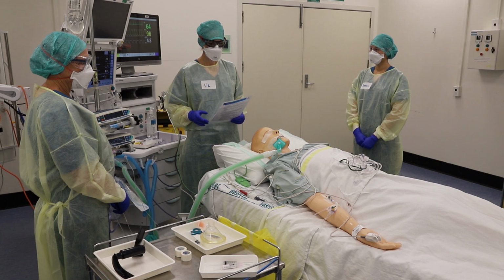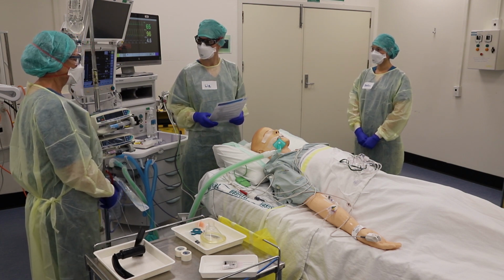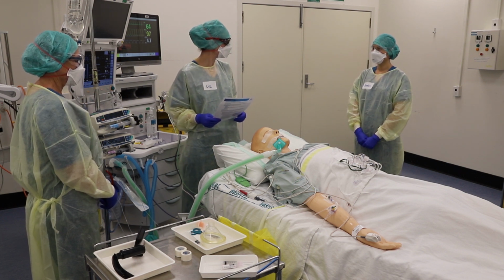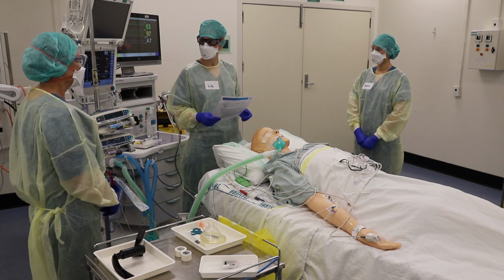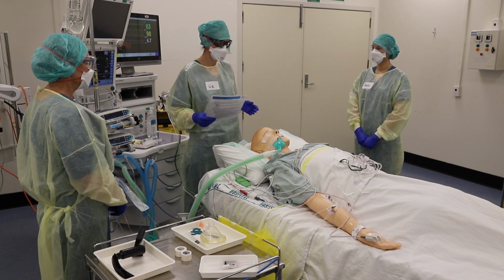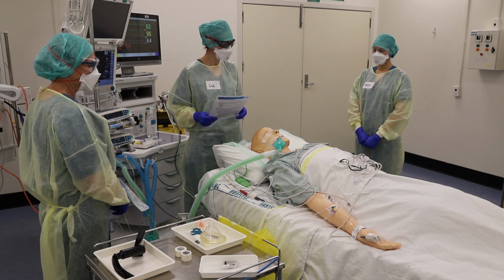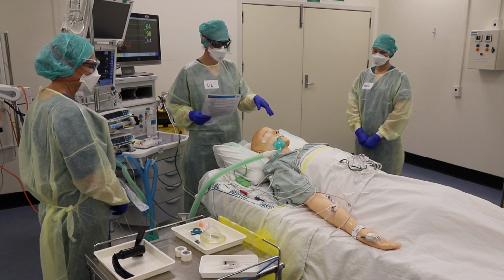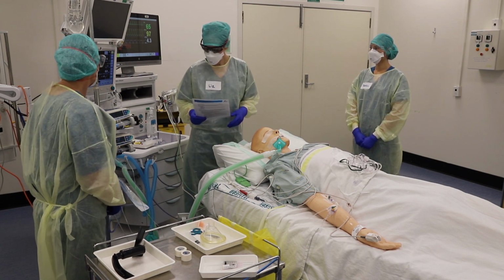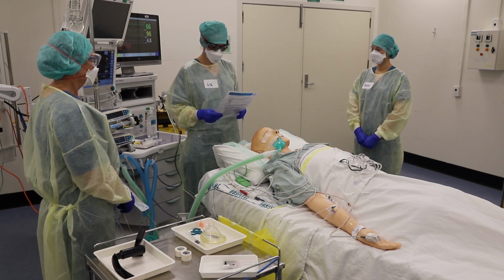We want to make sure that we have the best chances to extubate the patient as smoothly as possible the first time, so we're just going to take things slowly and carefully, the same as we did for intubation. We'll use closed loop communication, and if anybody sees anything at any point in time, please speak up, because this is a critical point in the airway management. In terms of optimising the conditions, so far we've got the head of the bed at a slight angle, which is good, and the patient is well oxygenated.